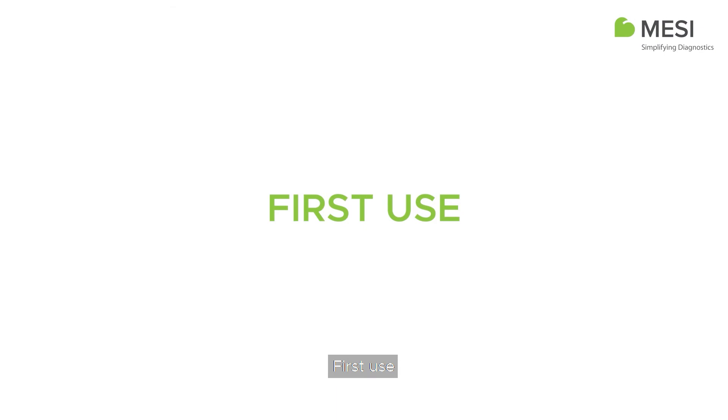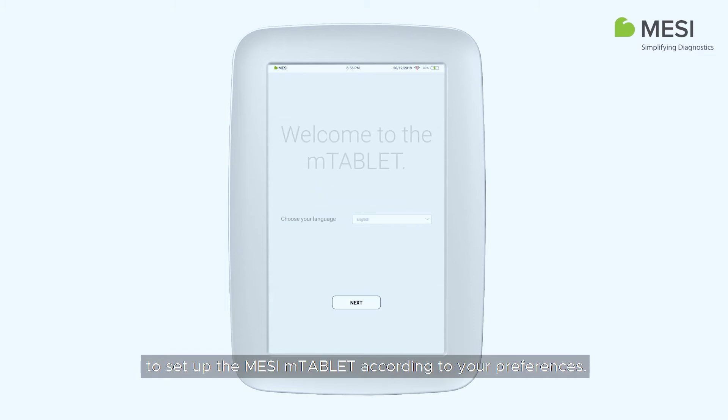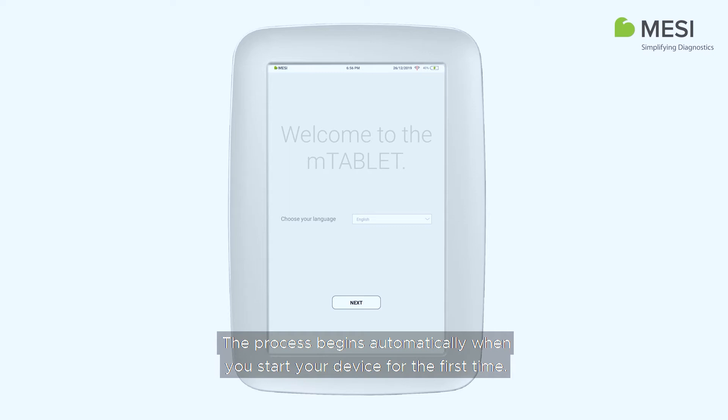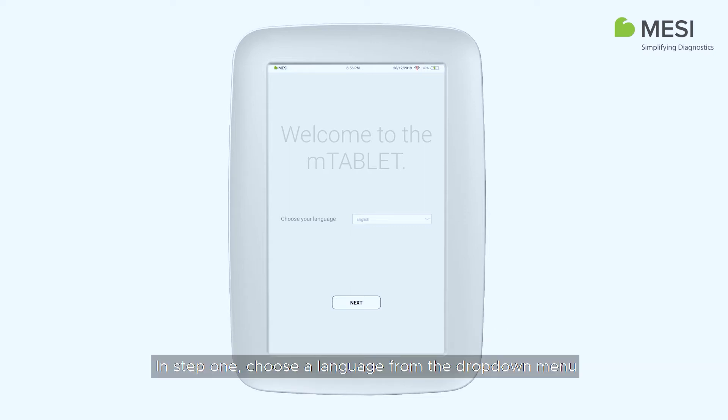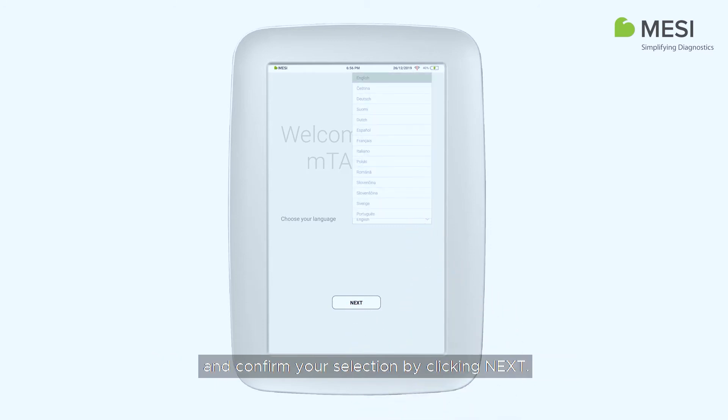Upon first use, you will need to follow a guided process to set up the MESI mTABLET according to your preferences. The process begins automatically when you start your device for the first time. In step 1, choose a language from the drop-down menu and confirm your selection by clicking Next.